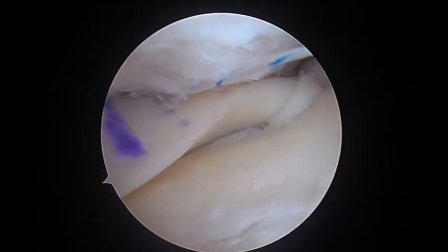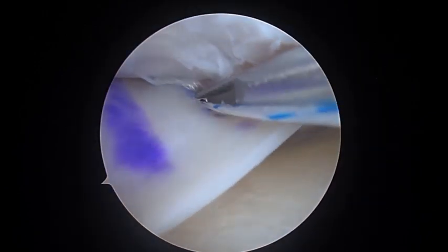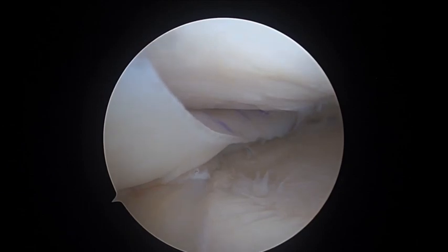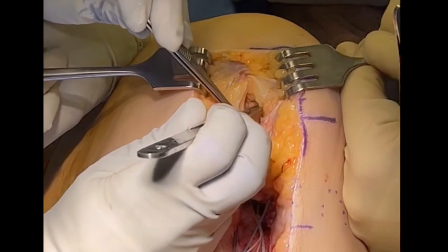We are careful to tension the graft appropriately before cutting, being cautious to avoid over-tensioning the graft, stressing the fixation. This technique results in a graft that is well tensioned and appropriately contoured within the medial compartment, as shown here. The anterior root suture is then passed down the anterior root tunnel with proper tension for a secure fit. Final fixation is deferred until the remainder of the procedure is completed.